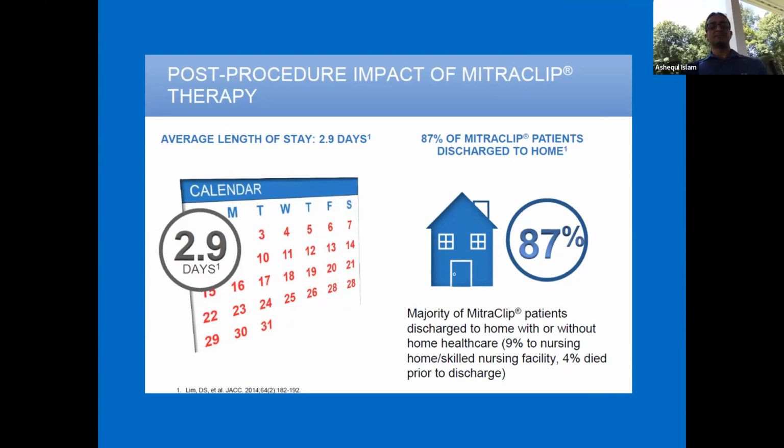We have done few mitral clip patients following TAVR. MR was significant enough even before TAVR. After TAVR, it did not improve. The afterload was reduced. Still, MR has become very symptomatic in these patients. And I have done few where we did TAVR followed by mitral clip.